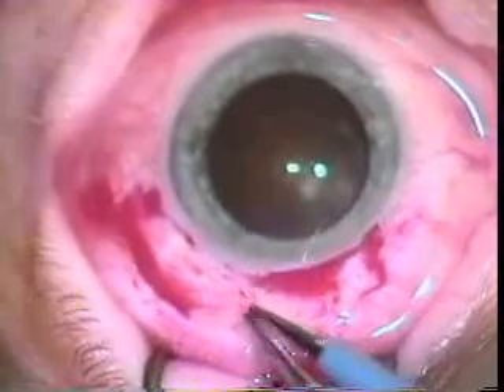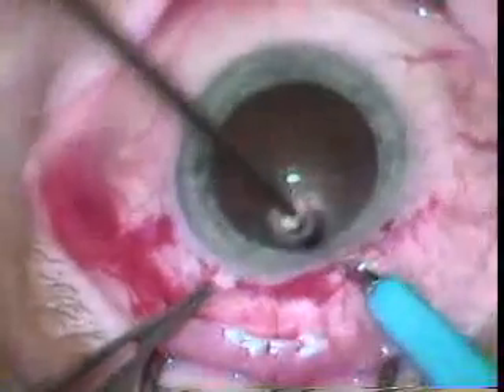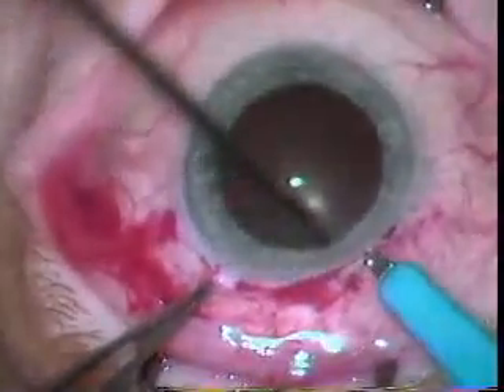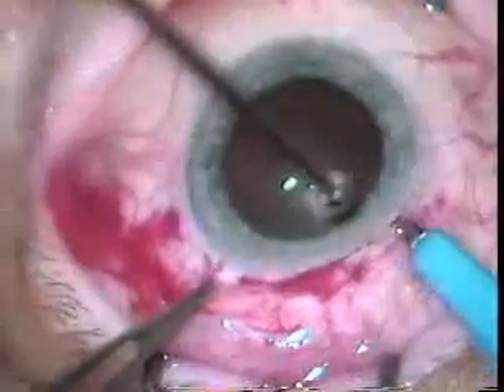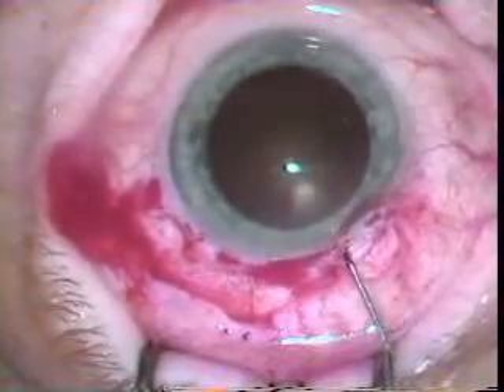Bipolar electrocautery is used to achieve hemostasis. Remember that it's important to have a spark gap for that to work. A 75 blade is used to make an initial opening into the eye that will allow a can opener capsulorrhexis.